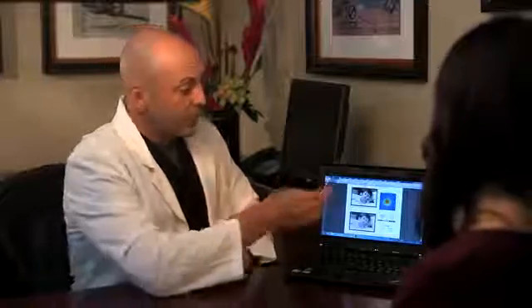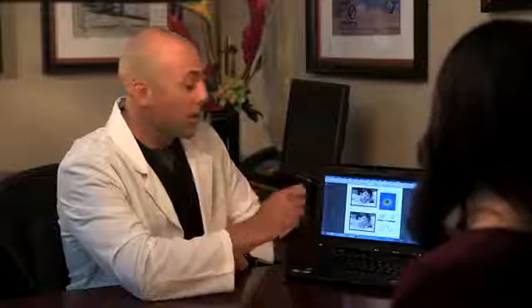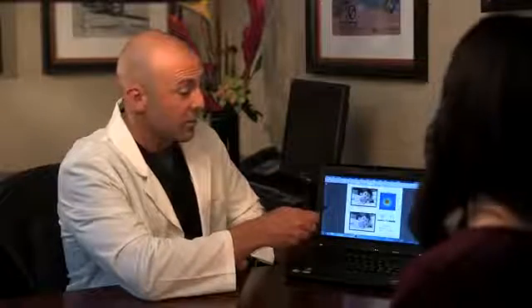So what you're going to see here in the top picture of the baby, this is how a perfect person would see, someone that has perfect vision. If someone had a clear optical pathway from their eye to the back of their eye, the retina, they would see like this. Now this is your eye. And you can see that it's a little bit blurry, and I don't want you to be concerned about that because we're going to do other tests to determine why you're seeing this way.